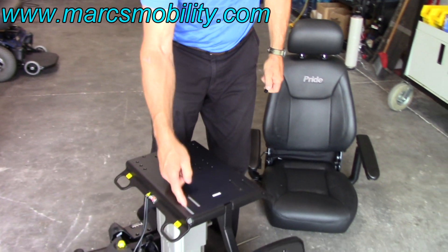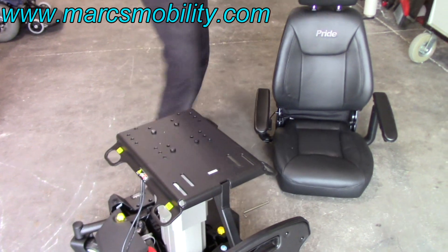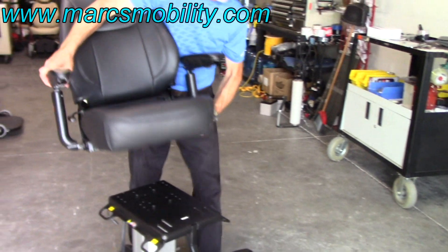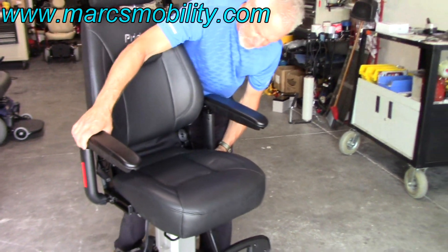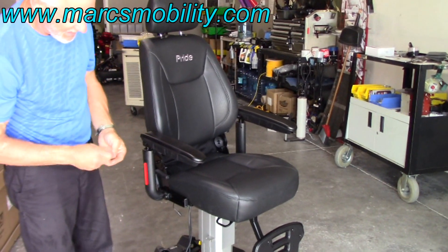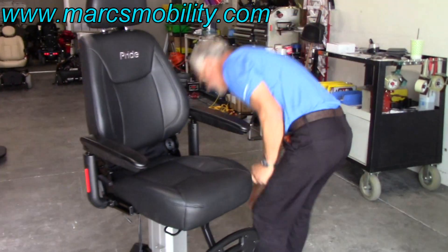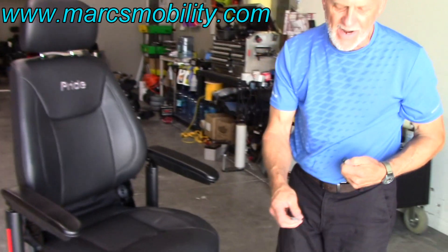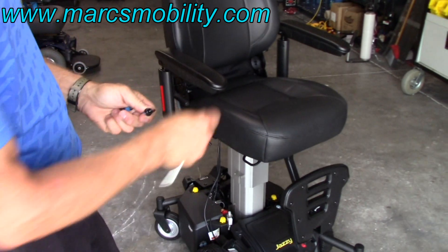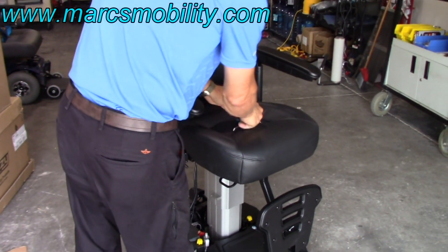You're going to use these two outside railings and these three holes right here for your bolts. Take your seat, put it on top of your chair. You're going to have to get on your back and put the four bolts in. You'll need an Allen wrench — if you have an Allen wrench set, this is the one you would need. Tighten up all four bolts on the seat so it's solid.